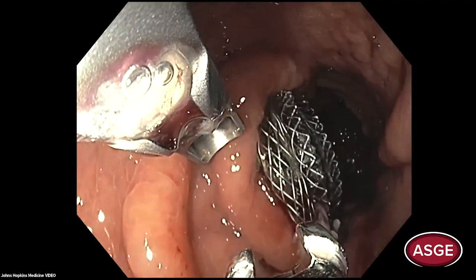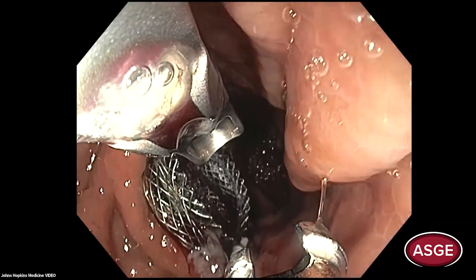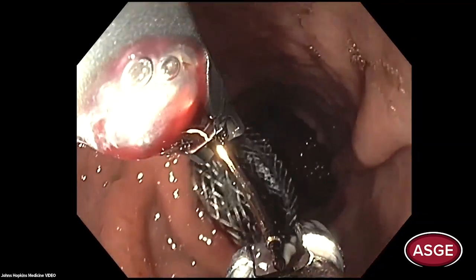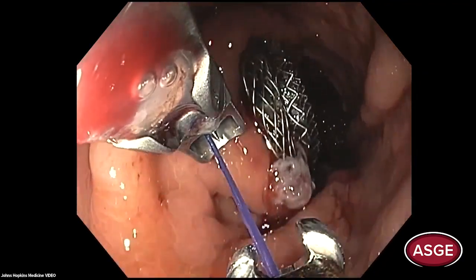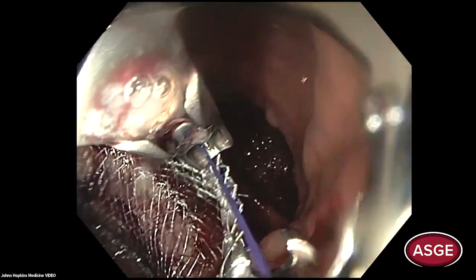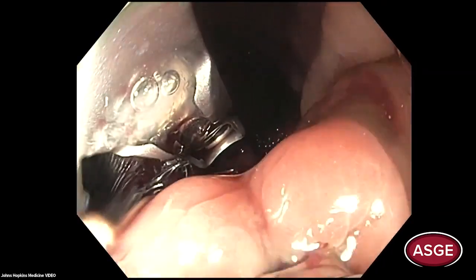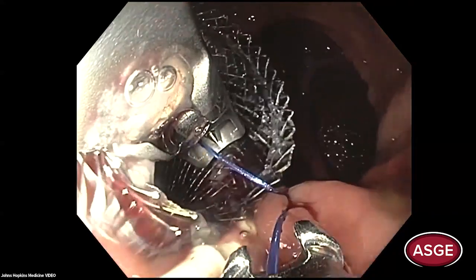For a one-stage EDGE procedure, the rule is: use a 20-millimeter AXIOS and anchor it, because that's how we've essentially eliminated migration and perforation. If we don't suture, I still worry about risk. Also during the procedure, if the stent is placed at a tough angle and your scope isn't going well with a lot of friction, you have to pause. Sometimes I've had to use an alternative scope — the Pentax scope is a little more flexible than the Olympus, so occasionally we've switched.